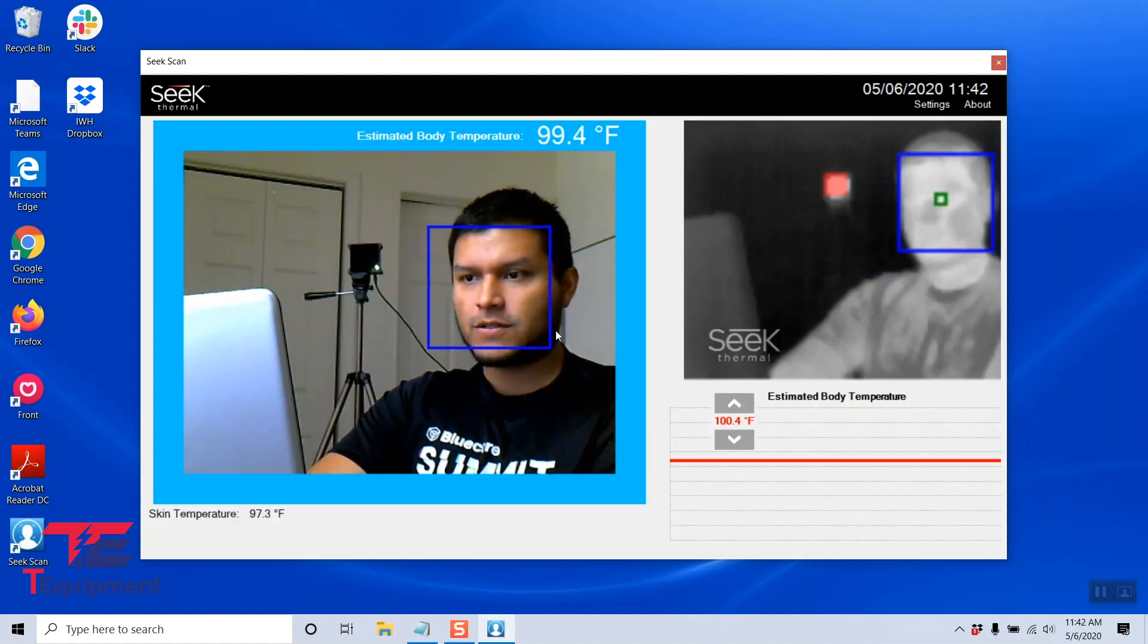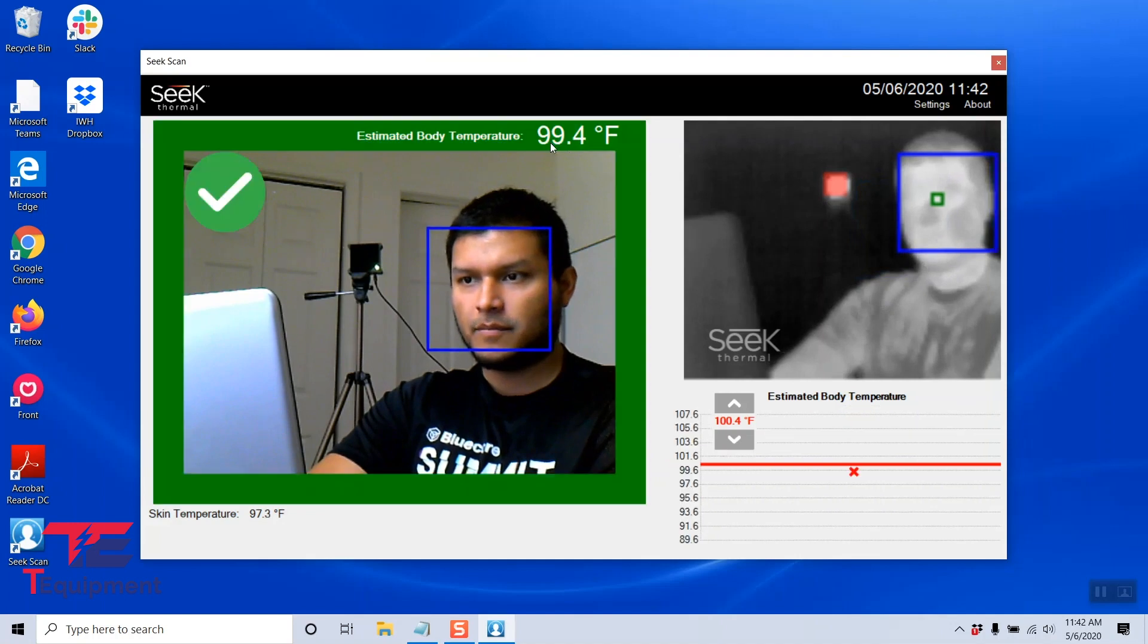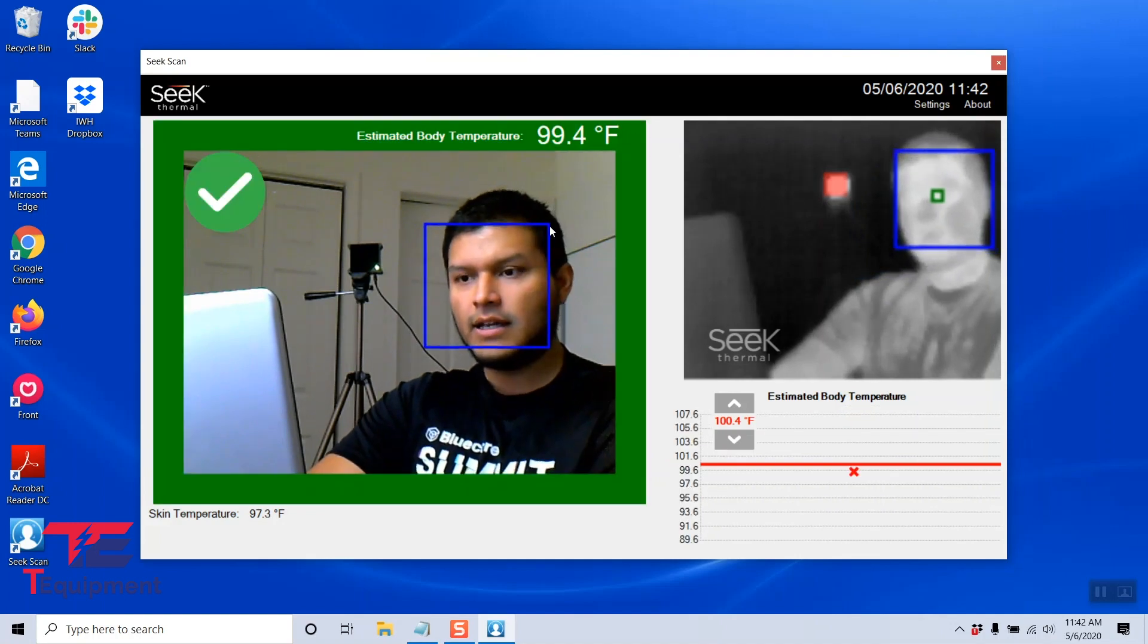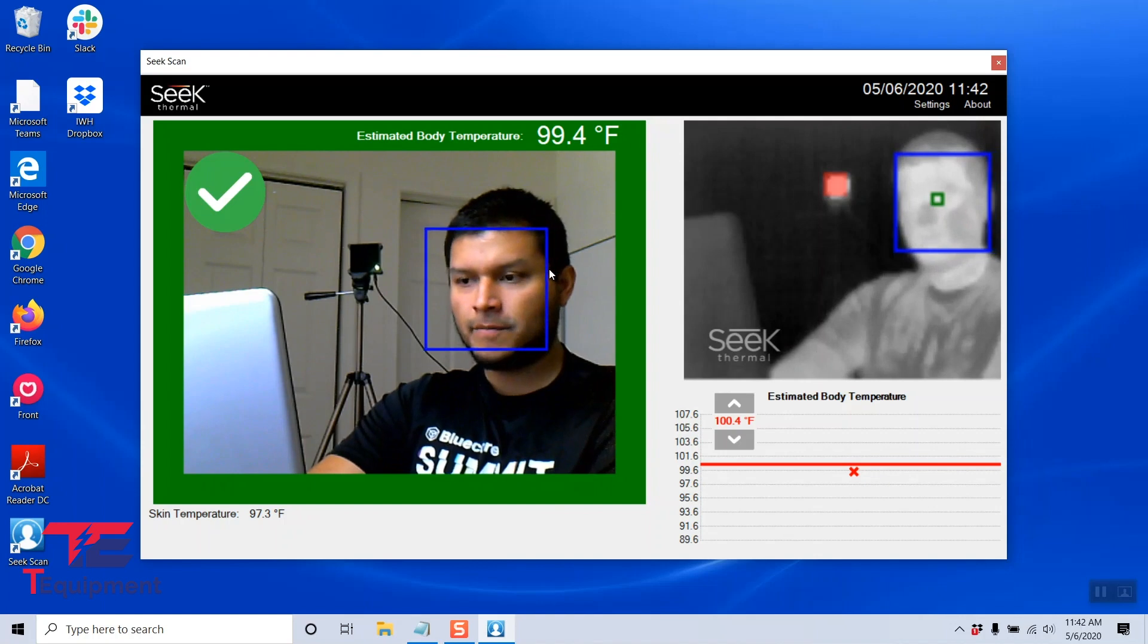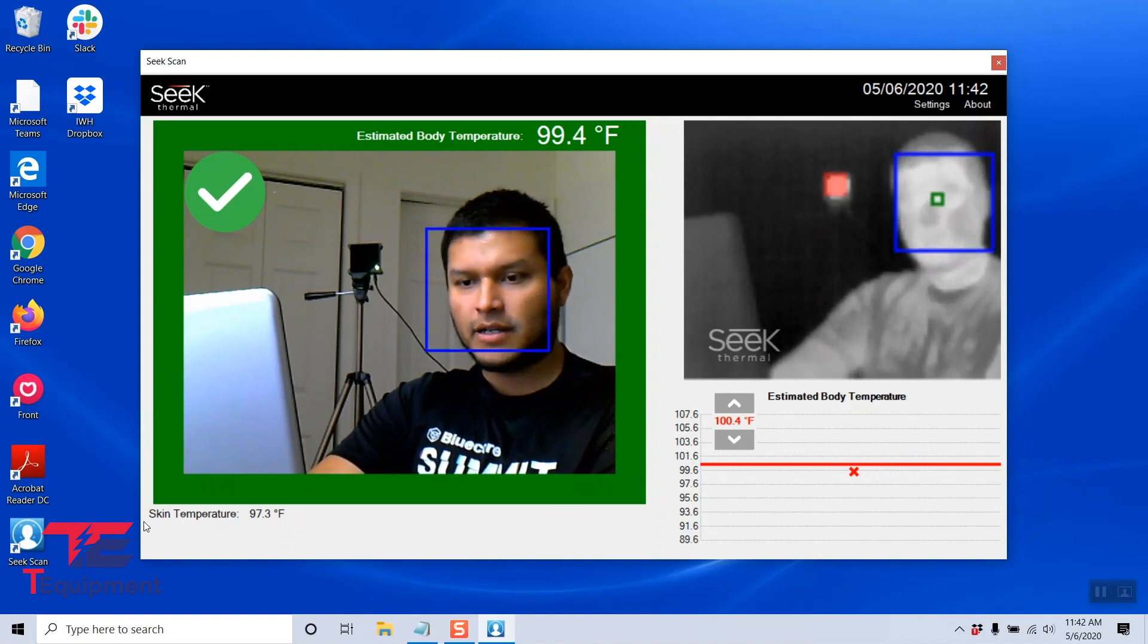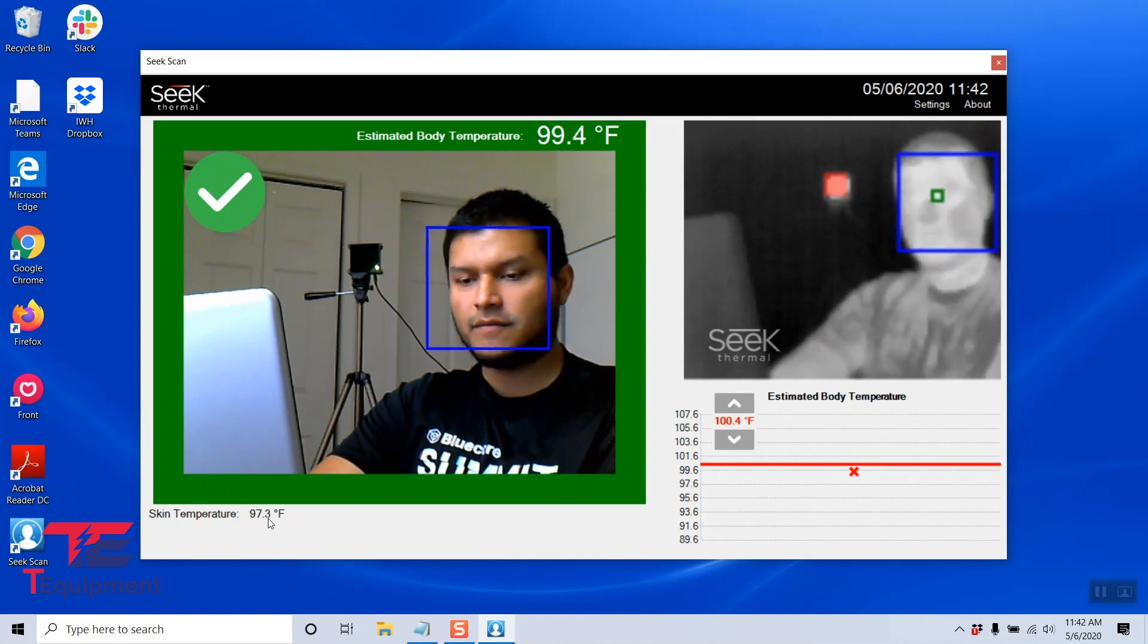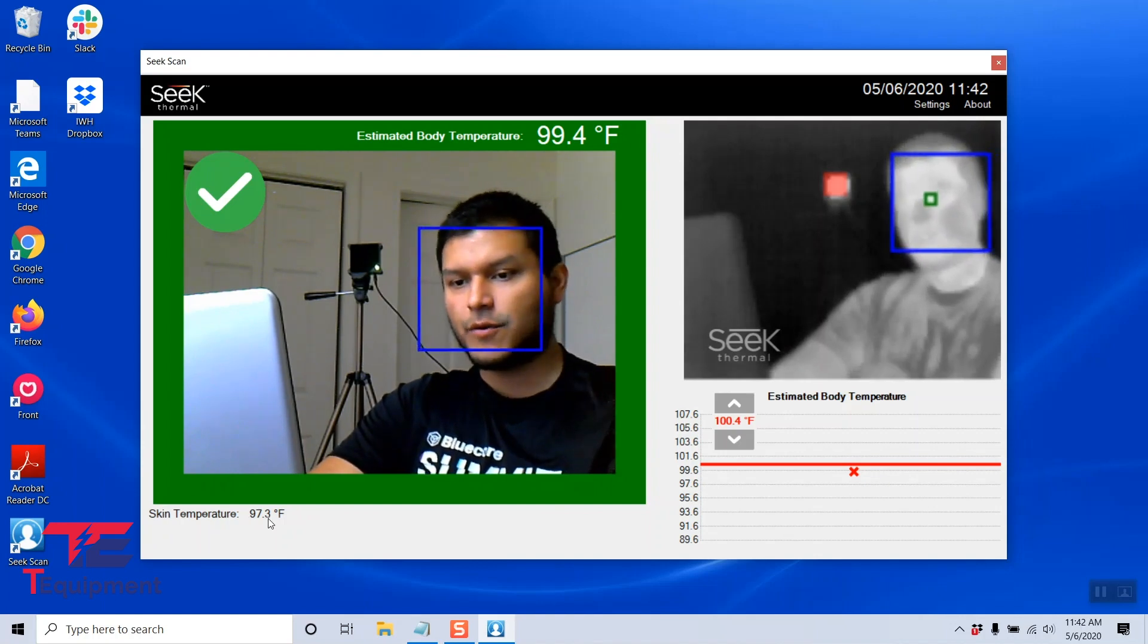And now the cameras are both loading. You can also see that we have a temperature reading in Fahrenheit. You also heard the pass alarm, and at the bottom left you can see the skin temperature reading of 97.3 degrees Fahrenheit.